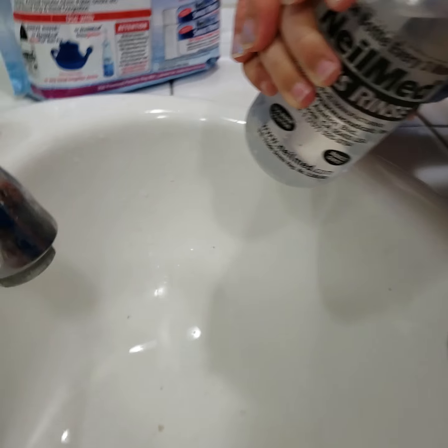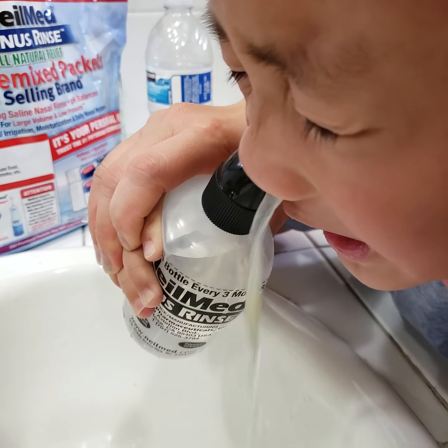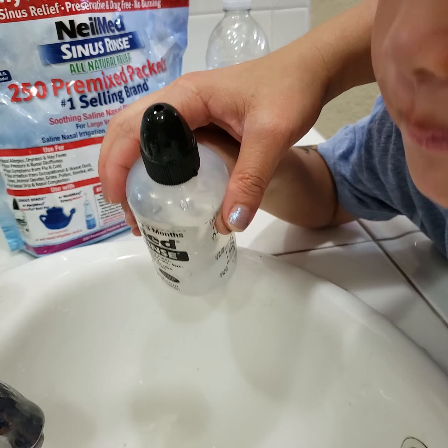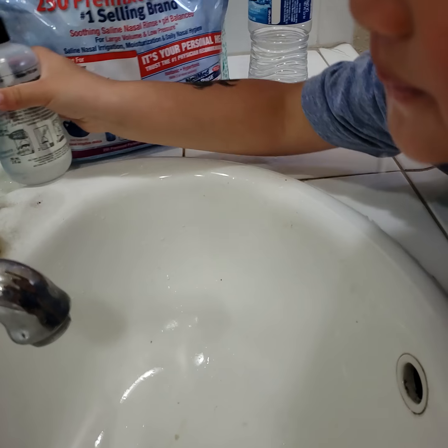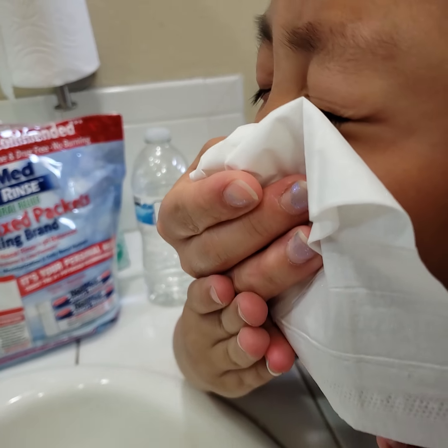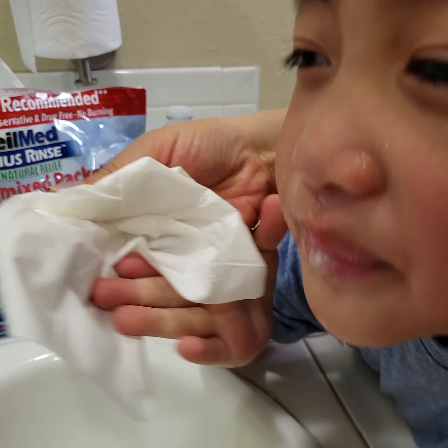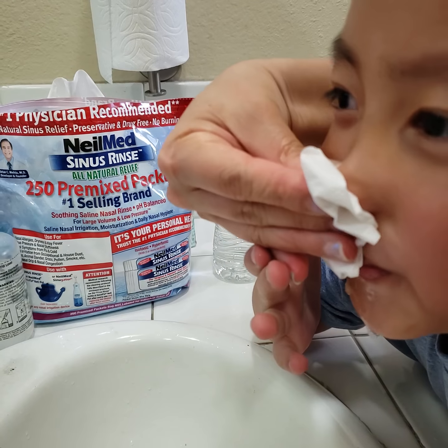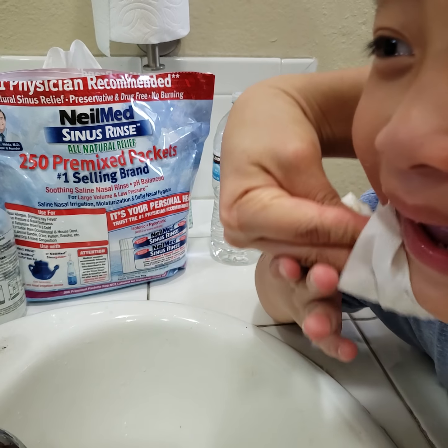Ready? Okay. Hold on. Did you see anything coming out? Are you okay? Blow your other nose, very careful. Gently blow your nose. Blow. You okay? You drink a little bit? It's okay.